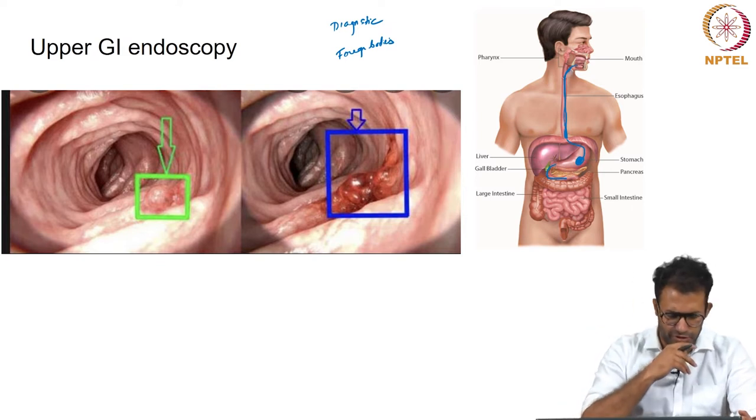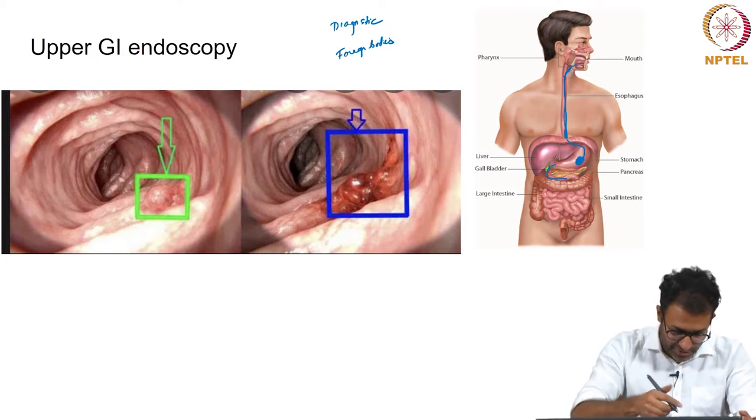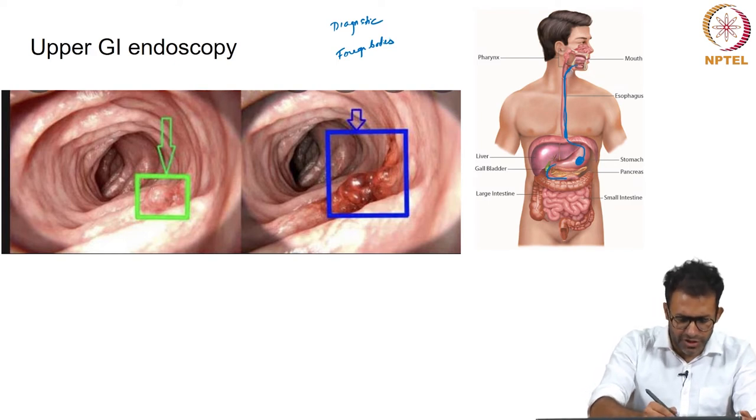Here what you see is an image where a computer vision tool has segmented lesions in an endoscopy.